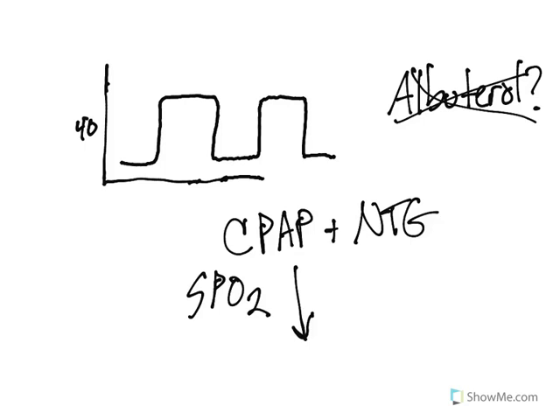There we go. All right, your SpO2 is going to be low on those patients. So you may see a normal end-tidal CO2, but you'll see a low SpO2. And if you think about when we talked about what goes across that water barrier in your CHF patients, CO2 goes across that water barrier just fine. It's O2 that can't get in, and that's the problem. CO2 will diffuse through that water without any problems, but O2 won't. So your SpO2 on those patients is low. Your end-tidal CO2 is normal, sometimes high.